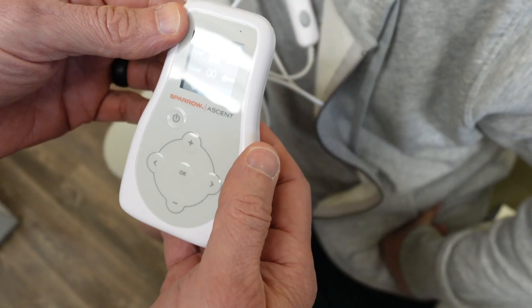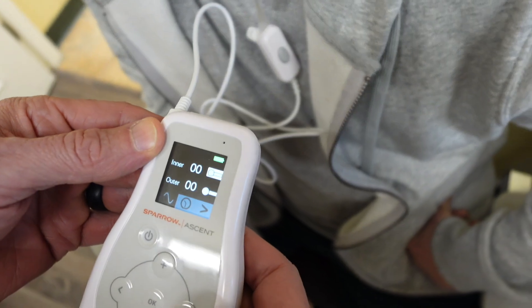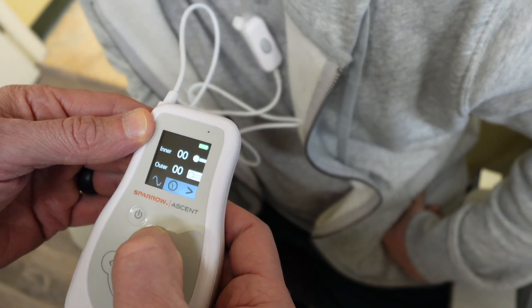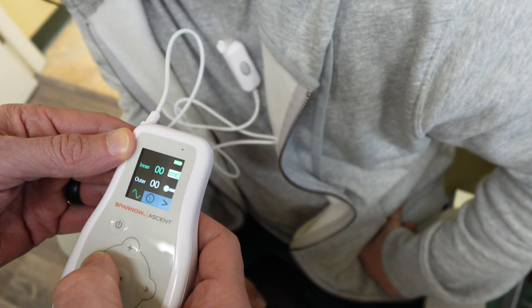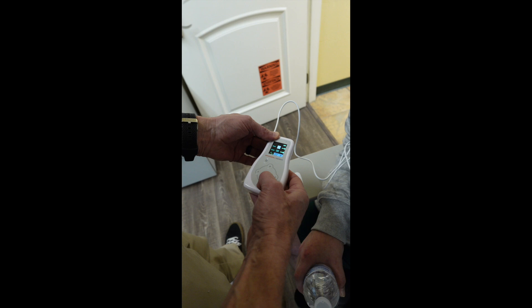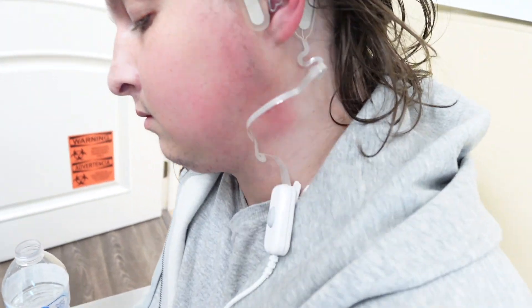I like the fact that it's easy to adjust. You can turn it on and off at each point, set the timer, then just kind of lay down and walk away. This is a drug-free treatment for opiate withdrawal called the Sparrow Ascent, made by Spark Biomedical. The price is going to be somewhere between $3,500 and $4,500 if you're buying the whole thing. If you're in a clinic, you'll probably just pay a rental fee and an earpiece fee, since the earpieces are throwaway but we can reuse the controller and cable. We have shipped some to patients who've worn them for a longer period of time.